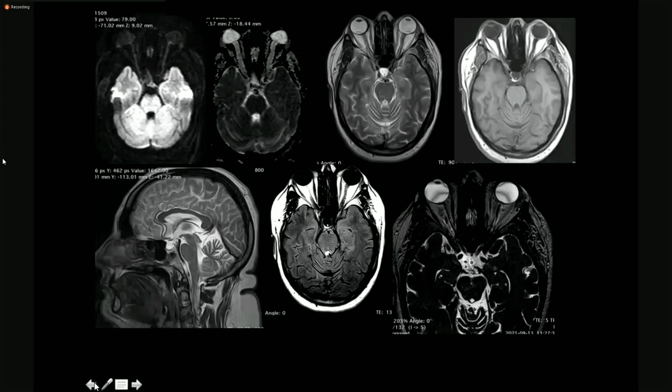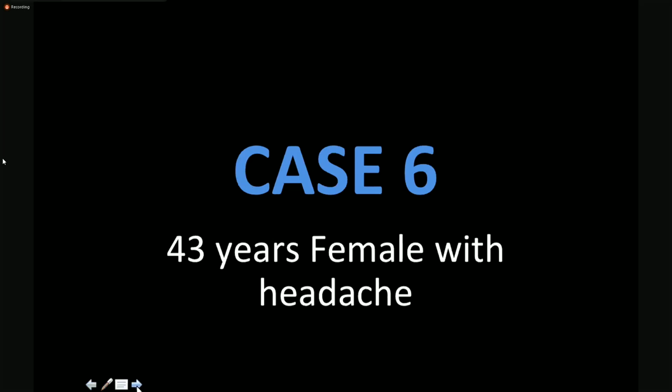And just focus on the history again. This is a 43 years old female with headache.